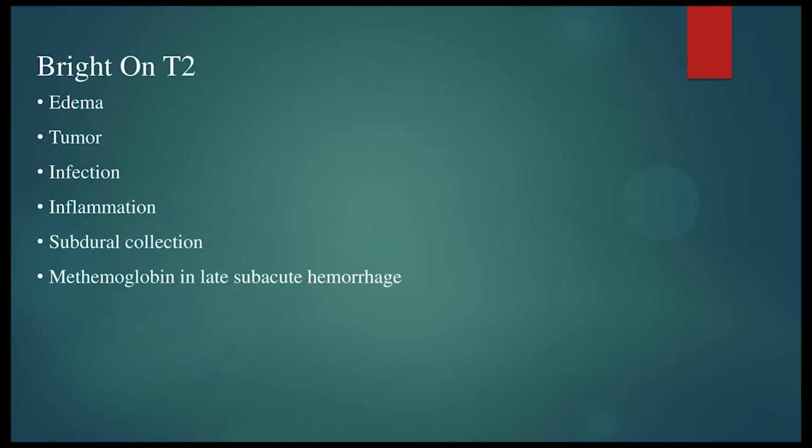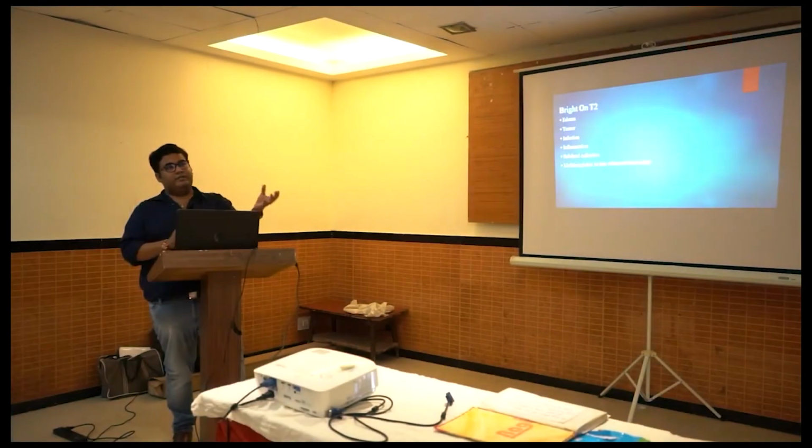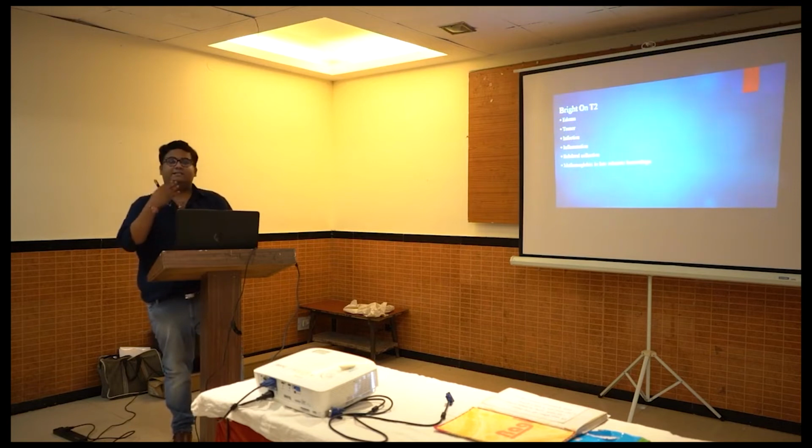In addition, we can understand that T1 weighted images are primarily used to understand the anatomy of the structure, where the pathology is and what is its location. And T2 weighted images are used to look for the pathologic state, where is the pathology and how it looks. MRI is all about location and tissue characterization, what type of pathology is there and where it is located. CT is just for the location and somewhere we can comment on the characterization of the tissue, but MRI is more sensitive and specific for tissue characterization.